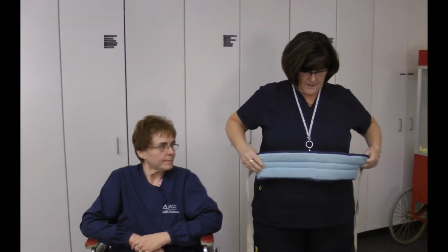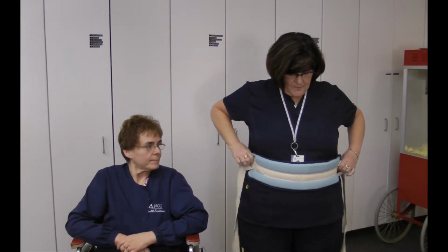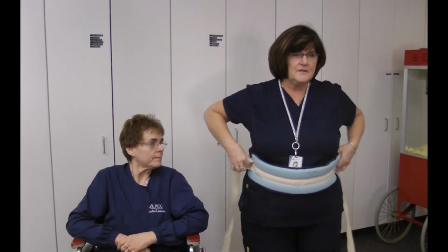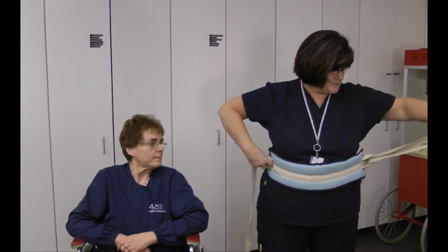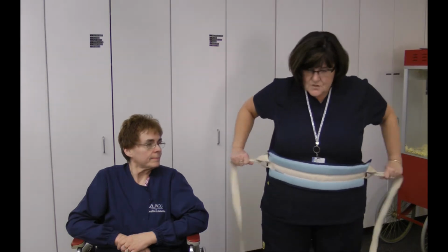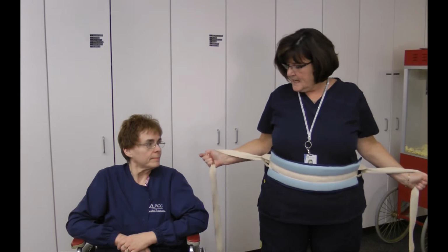There we go. Wrist restraints. The next one I'd like to demonstrate is a waist restraint. This will go on in the front, and this is the way it's usually put on. We cross the straps in the back, and then we bring them through the loops right here. Okay? This is where we hold somebody in, and then we tie these.